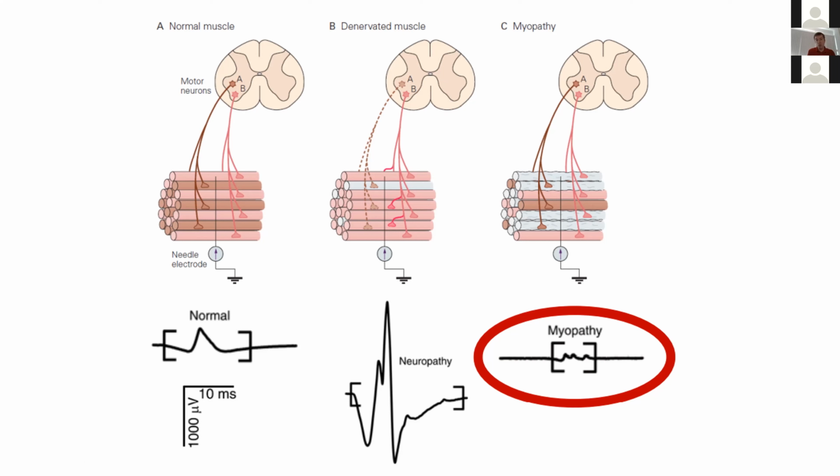The recruitment pattern will be faster than in a neurogenic condition. So we have a higher recruitment pattern with a lower frequency of one motor unit before another motor unit is recruited. Due to reinnervation, neuropathic motor units become bigger and wider, but especially in inflammatory myopathies like inclusion body myositis, those reinnervated neurogenic motor units are also common features.